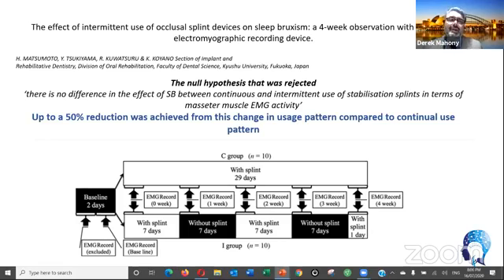But I've done my own diagnosis from my CBCT, which you've seen. I need the nasal cones, right? My nasal valve collapse, right? I used to use those Breathe Right strips before you put me onto the nasal cone. So that works for me, but on its own, not as effective. The mandibular appliance works for me on its own, not as effective. The lip seal works for me. But if I add all three together, I 100% feel better.